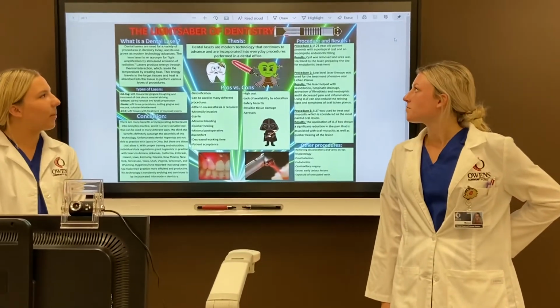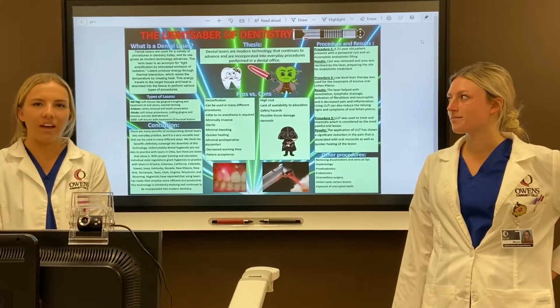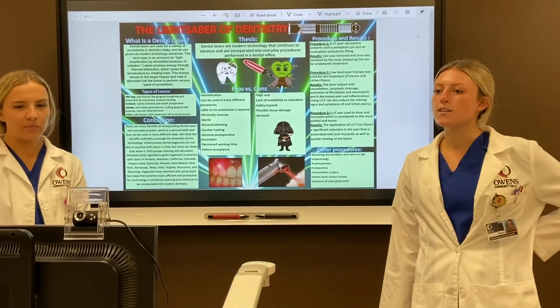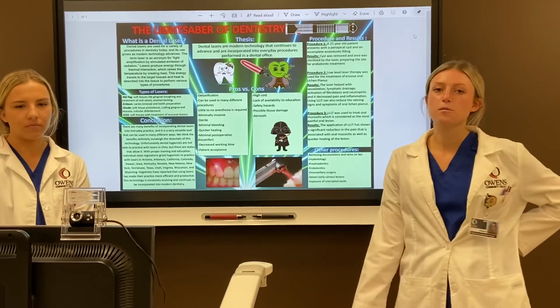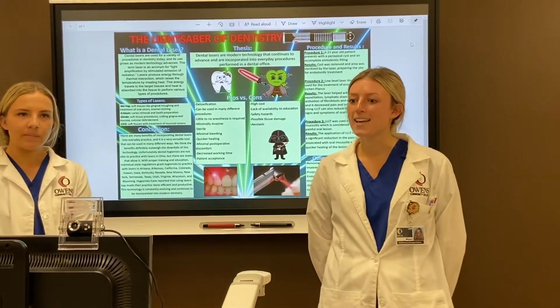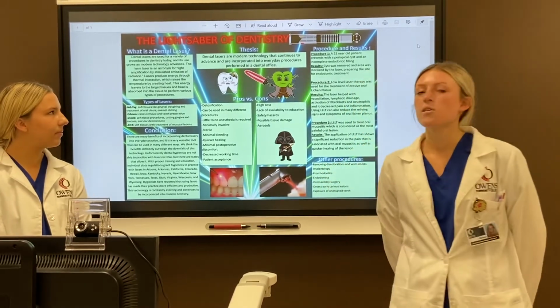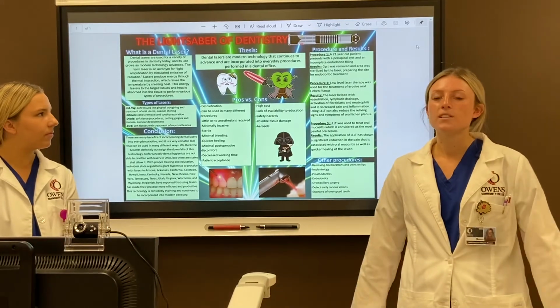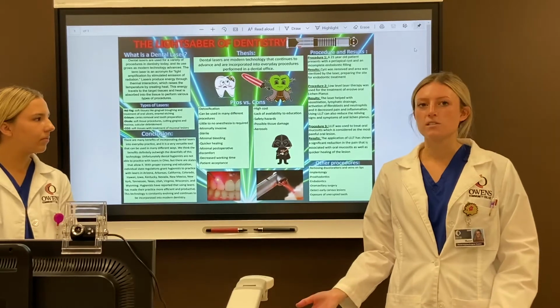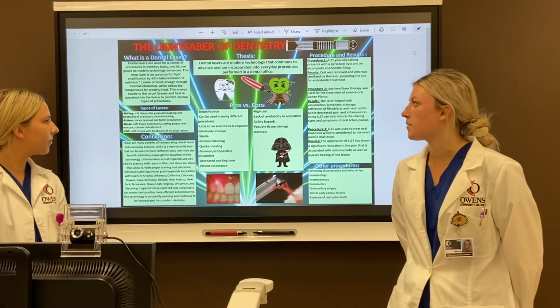So dental lasers are modern technology that continues to advance and is incorporated into everyday practice in dental offices today. Dental lasers are an evolving technology that are used for various types of procedures. The term laser stands for light amplification by stimulated emission of radiation. Lasers produce energy through thermal reaction, so they create heat, and that heat is absorbed into tissues to perform their procedures. There are 4 common types of lasers.